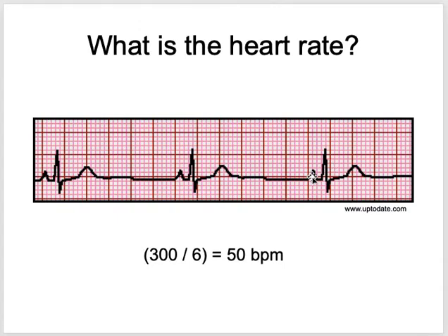Because there are certain conditions, you would understand when I go further in the lecture, in which the P waves are not followed by a QRS complex. Rather, maybe there is a P wave over here, a P wave over here, a P wave over here, right? So whenever you are assessing the heart rhythm, always look at the P wave first and then check the relationship of the P wave with the QRS complex. Remember that one P wave should always be followed by a QRS complex.